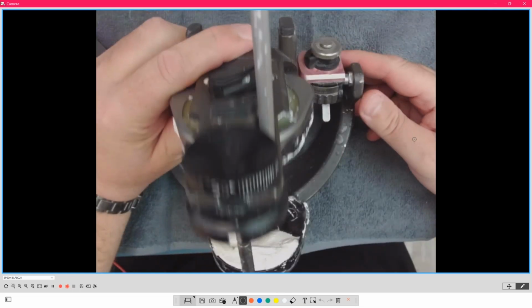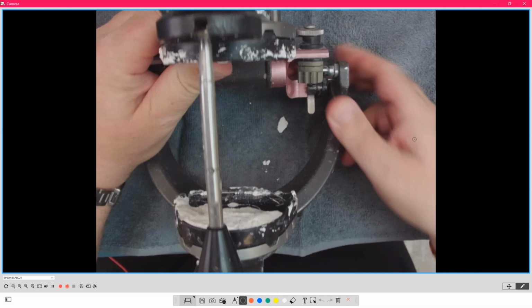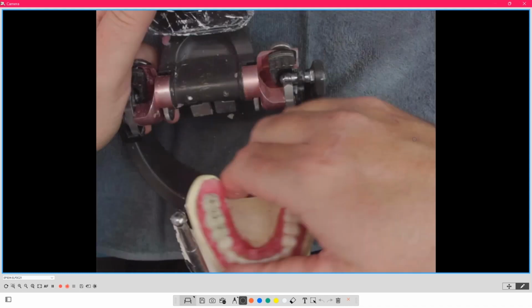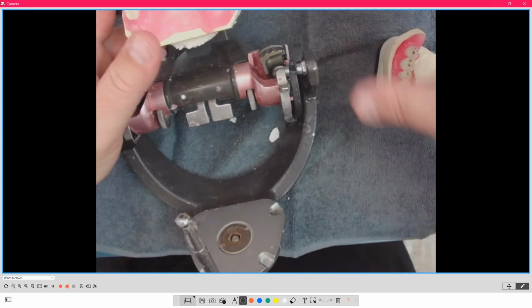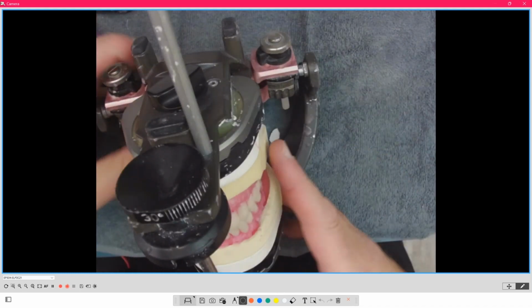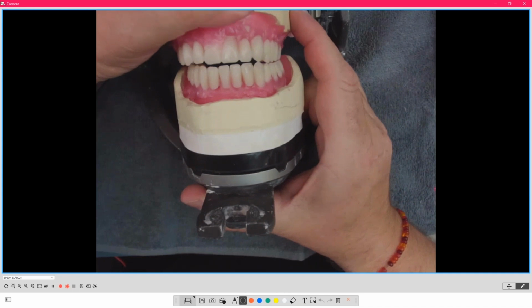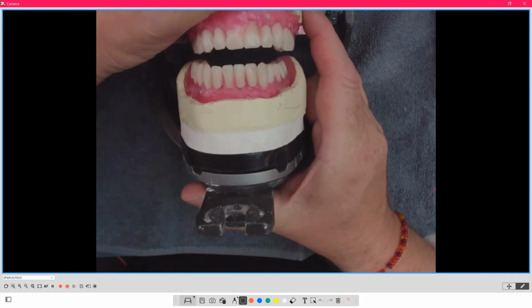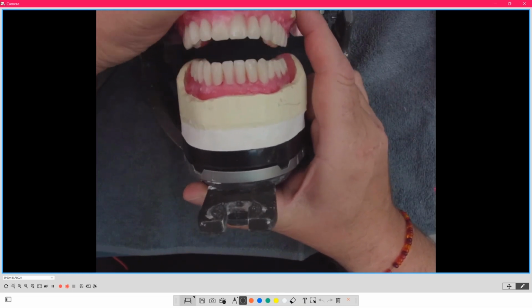So you can see it's in production. It's nice and dirty. And again, I don't do this. I actually move it in a chew cycle. I'm trying to emulate a chew cycle, remembering to go both ways, and I'm thinking, what's that chew cycle for that person?